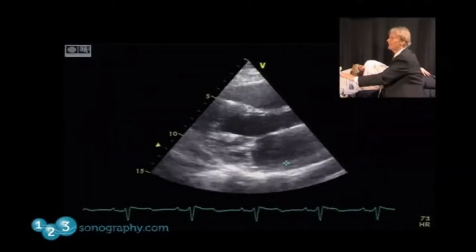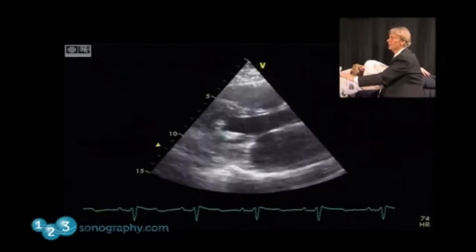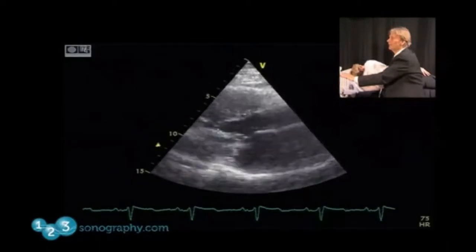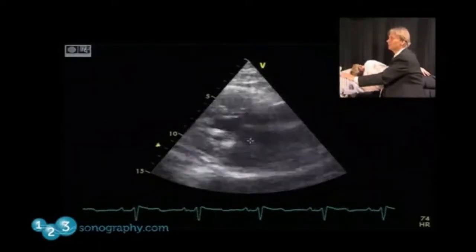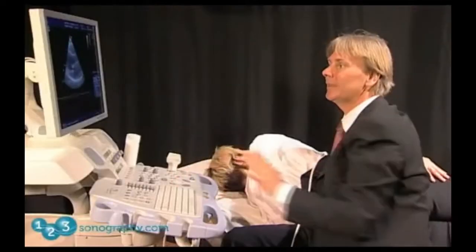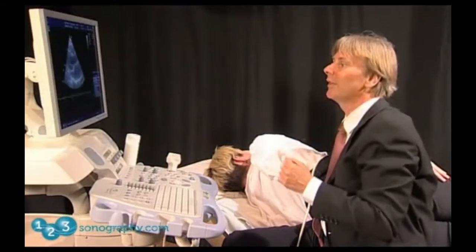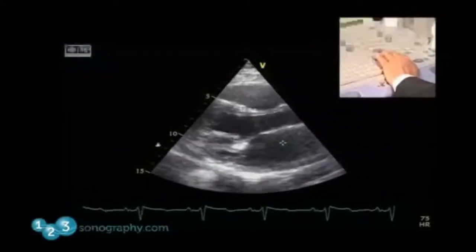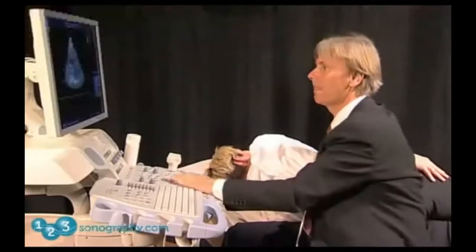thereby look at the subvalvular apparatus. So this is the tendinae, the papillary muscles, and you can appreciate the thickening of the subvalvular apparatus as well. This is a typical spectrum of changes that you see following rheumatic heart disease, with doming of the anterior leaflet as the leading problem in this patient.